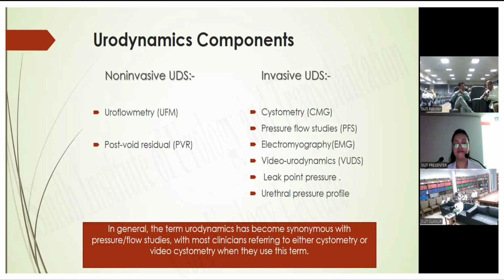Technologists should not read these graphs. We should read and report these graphs, as I saw in other countries where I went for training. The technologist was doing these tests, but the report was generated by a specialized doctor. So we should report these.